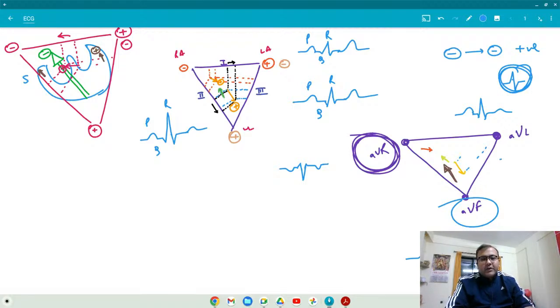So now you know how to read the limb leads, all the limb leads, where negative deflection, where positive deflection, which one is more negative, which one is less negative, which one is moderate negative. You know everything. Yes or no? Tell me.